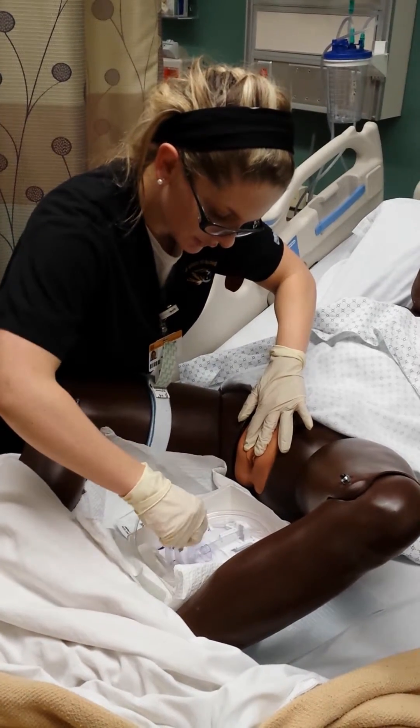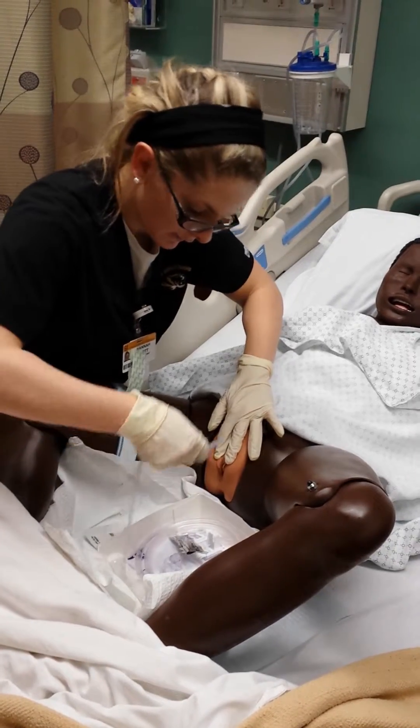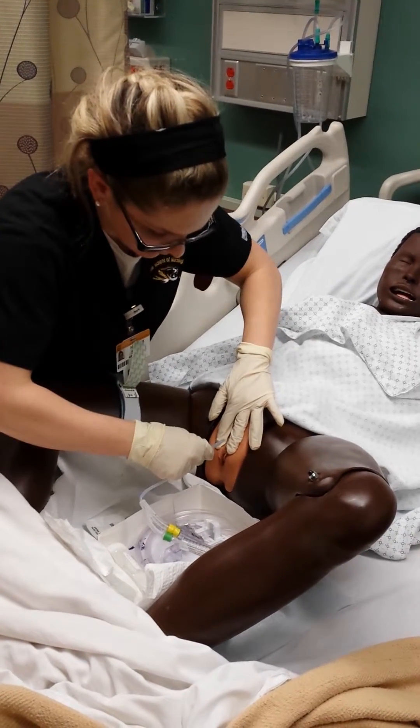We're getting ready to insert, so just go ahead and bear down like you would if you're going to the bathroom, and then just breathe while I further the catheter inside. Ready? Here we go.